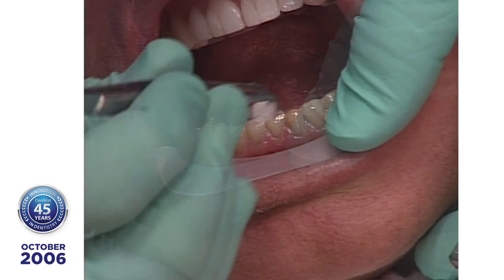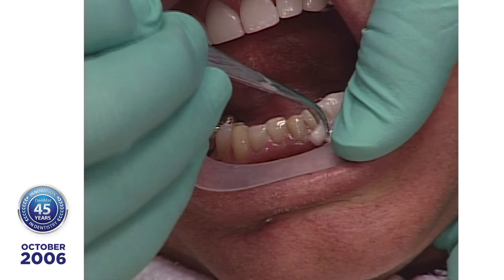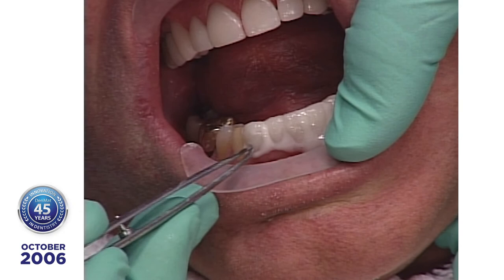Left cuspid, okay. You can just sort of tap these down. I always want too much rather than too little so that I make sure I don't have any voids. This is a very critical time. You don't want to have your dental assistant trying to read the instructions and figure out what to do next when you're doing this.